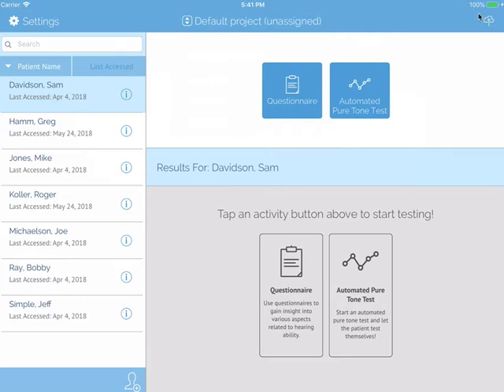When you are connected to Wi-Fi, anything that you create on the iPad — whether that be patients, projects, audiograms, or questionnaires — will automatically be copied over to the Shoebox Data Management cloud-based portal. You do not need to be connected to Wi-Fi to perform a test. In cases where you do not have Wi-Fi connection, the data will remain stored locally on the iPad. Once you have re-established your Wi-Fi connection, then the sync to the portal will take place.